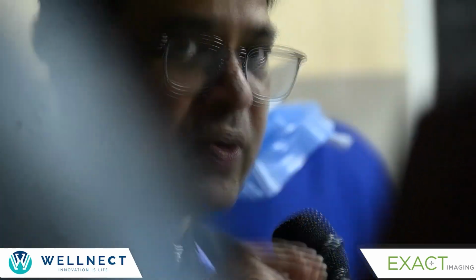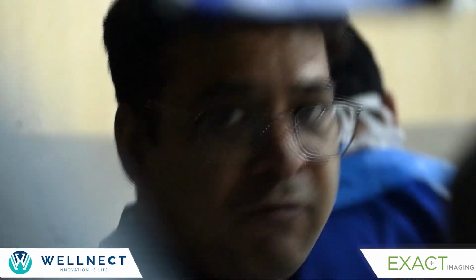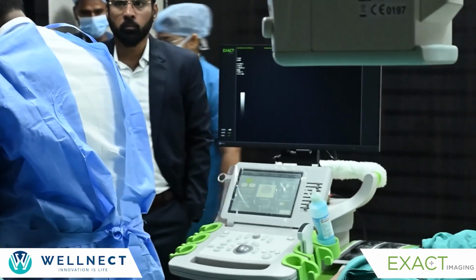Let me just, Dr. Abhijit has already told you about the difference. Now this machine, if you focus on that, you can see the armamentarium there, Tahir.